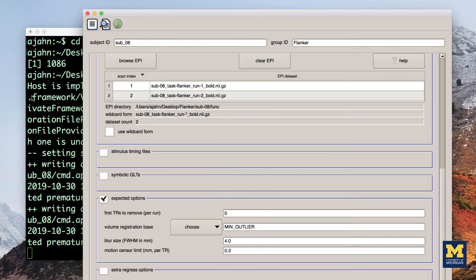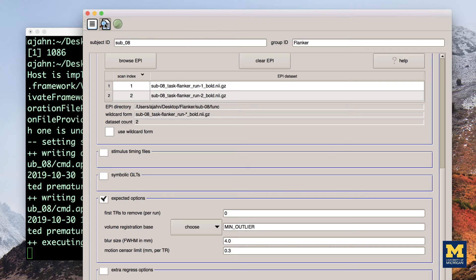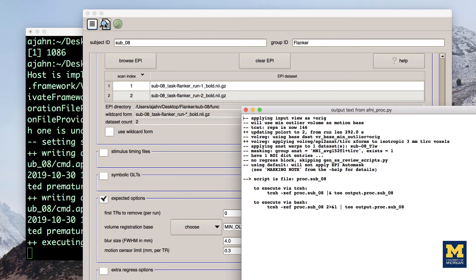Now click on the next icon, a magnifying glass over a sheet of paper. This will execute the AFNI PROC PY code listed in the previous window, and return any warnings or errors that you should be aware of. We don't have any in this case.